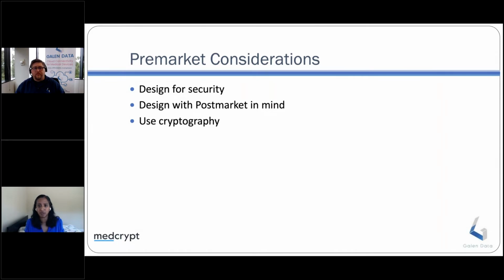the folks responsible for maintaining the security of the devices or updating or patching are also often responsible for maintaining their enterprise email server, right? These aren't people dedicated to device management. They're most obviously capable of keeping devices up and making sure that they're available for use. And a hospital, especially in the last couple of years, has really proven that they are under constraints in terms of delivering care, and they have to be focused on delivering patient care versus anything else.